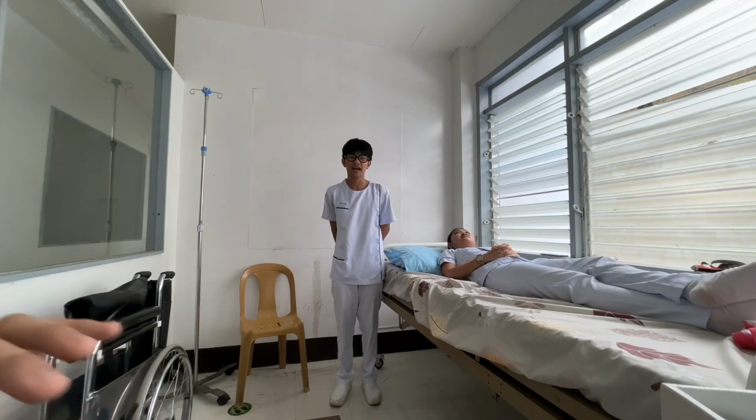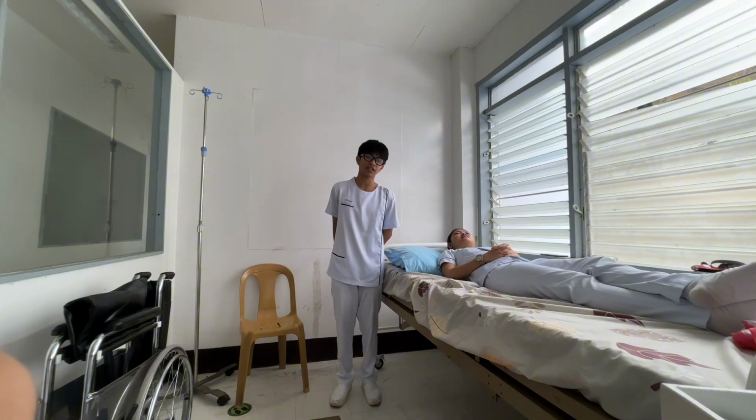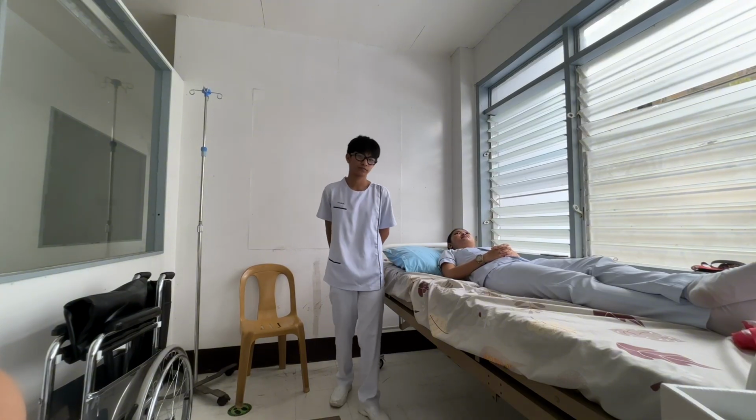First is check the client's chart if there is a physician's order to transfer the client from bed to wheelchair, and check for any restriction that may influence the client's ability to move or to be repositioned. Check for the tube, IV lines, incision, or any equipment attached to the client to avoid any accidental removal.